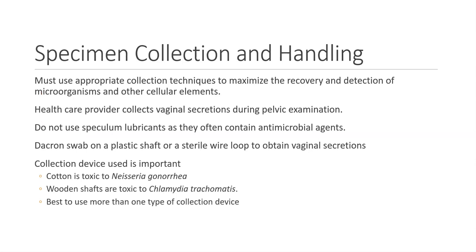As always, specimen collection and handling are crucial for accurate laboratory results. The healthcare provider must use appropriate collection techniques to maximize the recovery and detection of microorganisms and other cellular elements. The healthcare provider collects vaginal secretions during a pelvic examination. They are told not to use speculum lubricants as these may contain antimicrobial agents. So if we're looking at bacteria as the causative agent, these will be dead and will not grow in culture.